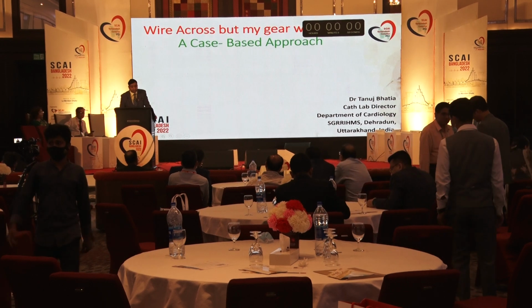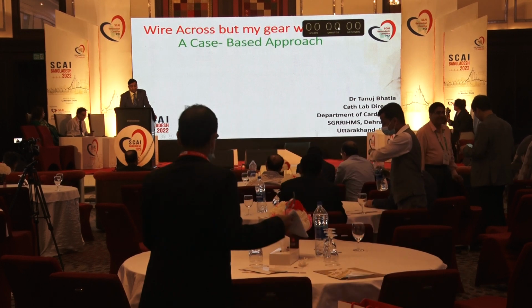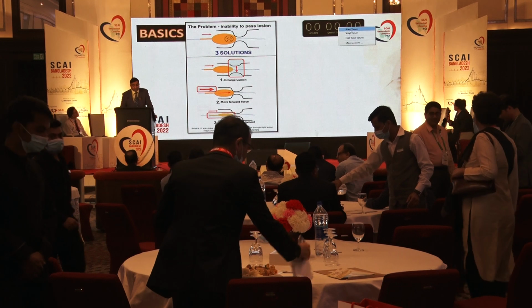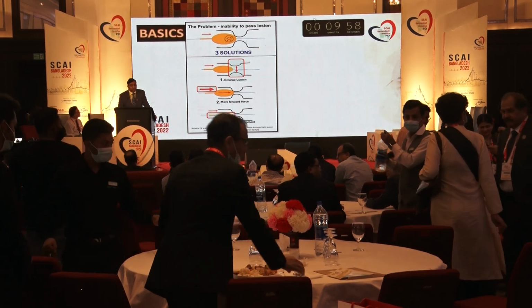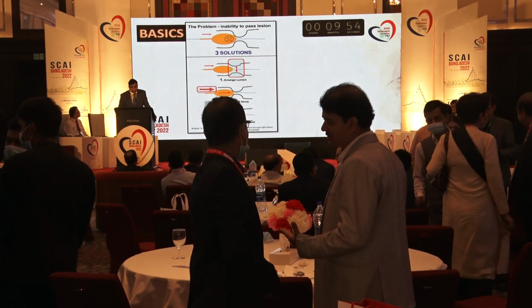This is not the algorithm for how we access a lesion once the wire is across but the gear won't go. So basically, the balloon is uncrossable, the problem being that we are not able to pass anything except the wire.